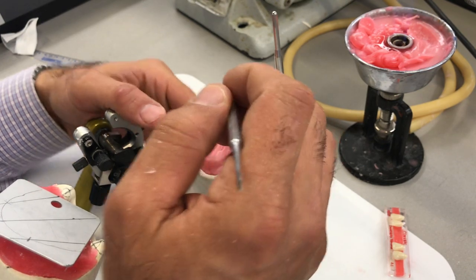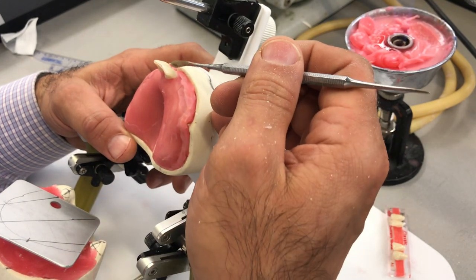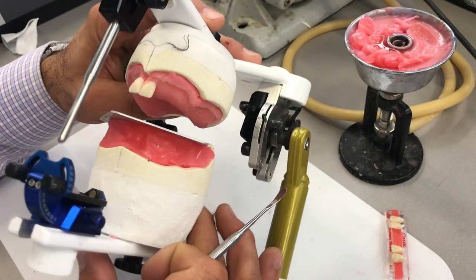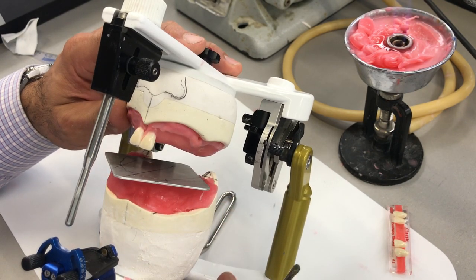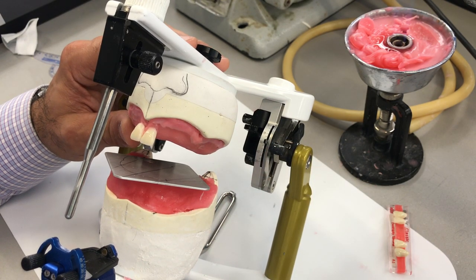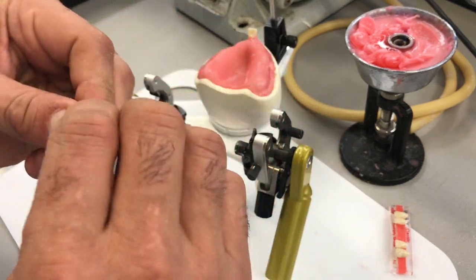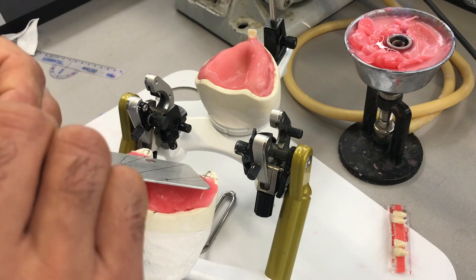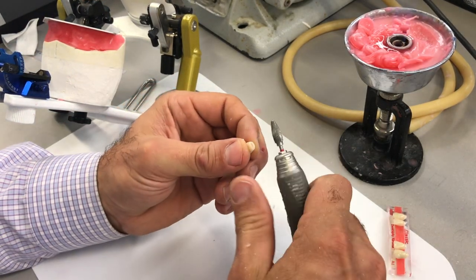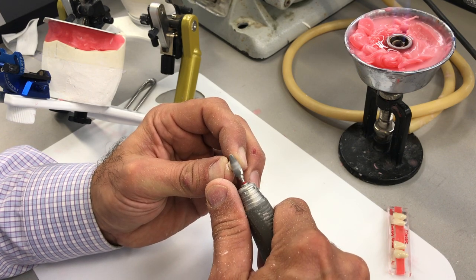I need enough space now between the tooth and the base plate so I don't have to trim anything. It looks like the cervical third of this tooth is interfering with the base plate. I can trim the base plate, trim the tooth, or trim both. When we were fabricating these base plates, we made a conscious effort to keep the interior ridge lap portion labial to the crest of the ridge slightly thin. I'm going to reduce a little bit of the tooth, but be careful not to reduce the cervical margin, which mimics the CEJ, because we're going to need that for our wax-up.